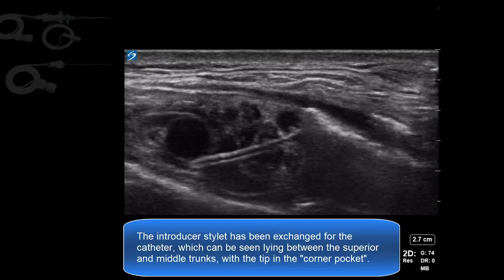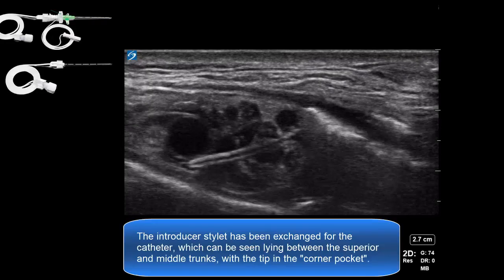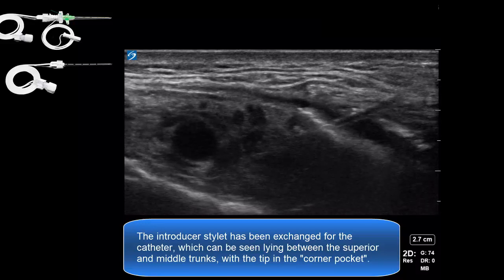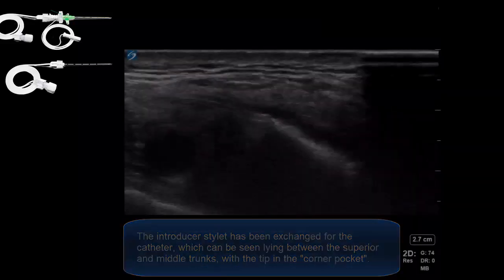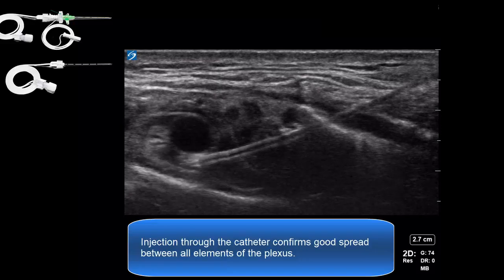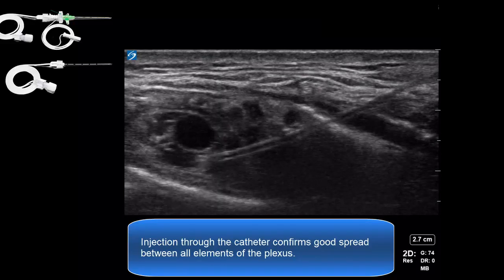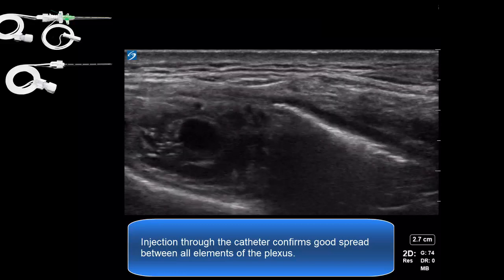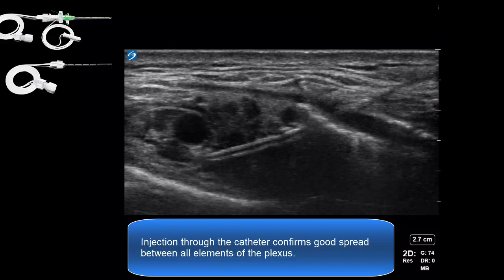Here, the introducer stylet is exchanged for the catheter, which can be seen lying between the superior and middle trunks with the tip in the corner pocket area. A test injection through the catheter is performed, and this confirms good spread, lifting the artery up. This local anesthetic will track back along the catheter and spread to the superior and middle trunks as well.